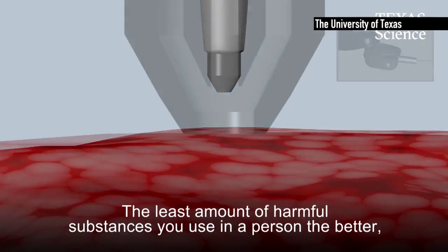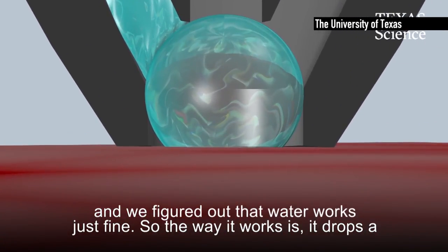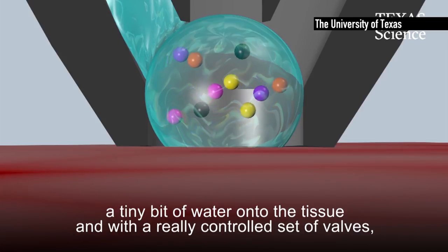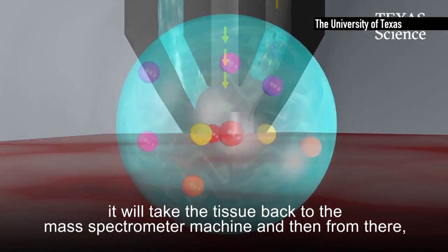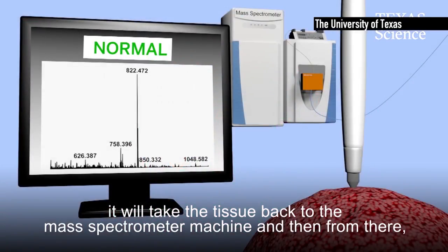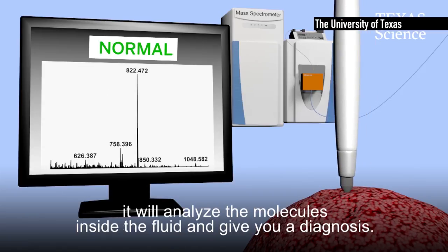The least amount of harmful substances you use in a person the better, and we figured out that water works just fine. The way it works is it drops a tiny bit of water onto the tissue and with a really controlled set of valves it takes the fluid back to the mass spectrometer machine, which then analyzes the molecules inside the fluid and gives you a diagnosis.